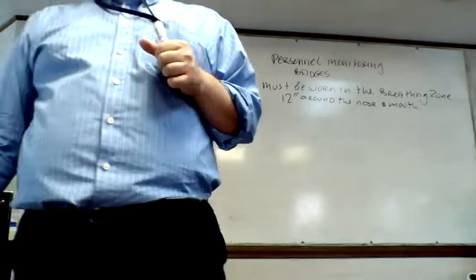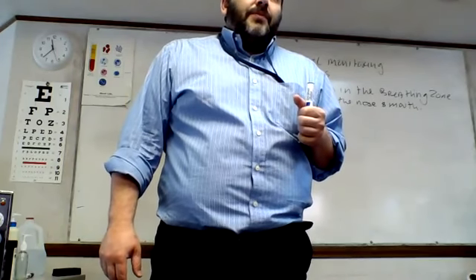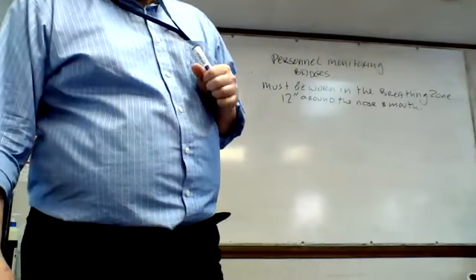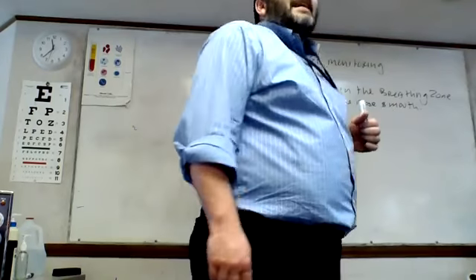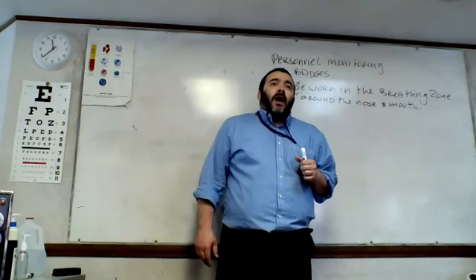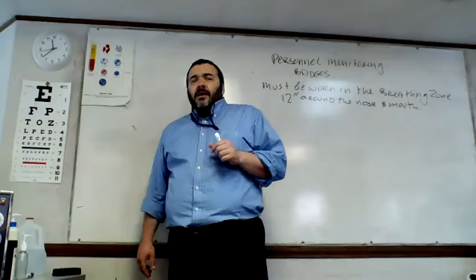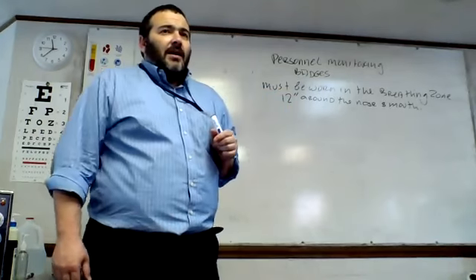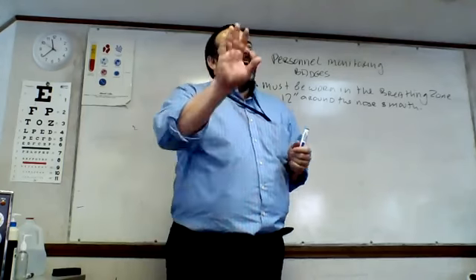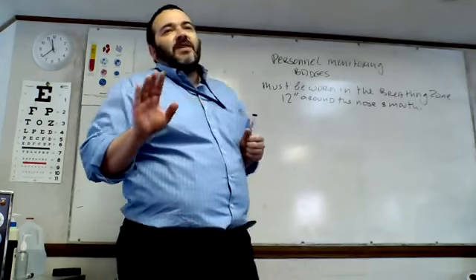And as you inhale, if there's toxic gas around, what does the badge do? It doesn't do anything to help you. What it does is that it monitors what you have been exposed to. And once a month or whatever the policy may be, you will mail that in, and you will see if you have been exposed to anything. And then you know whether you're dying or not. No, not quite so extreme. There are different types of badges designed for different types.